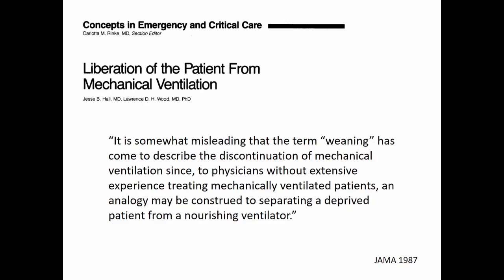And so the faster you get off the ventilator. Moreover, the process of getting the patient off the ventilator is not as gradual as what weaning would imply. When you wean a drug or other therapies, wean pressors, you typically do so gradually over an extended period of time because the patient has become somehow dependent on the drug, whereas many ventilated patients are ready to be liberated after they've recovered from their primary insult. And so the task of the clinician is to recognize at the earliest possible opportunity when they can separate the patient from the ventilator, and in so doing liberating them rather than just weaning them over time.